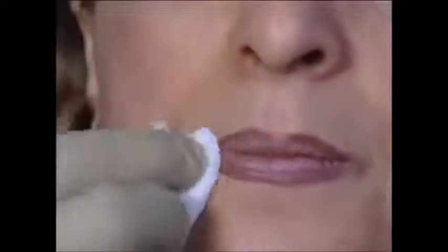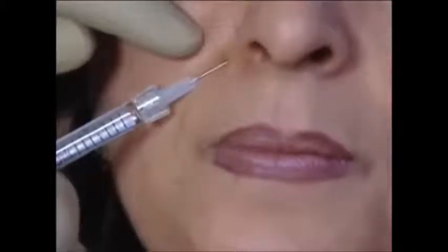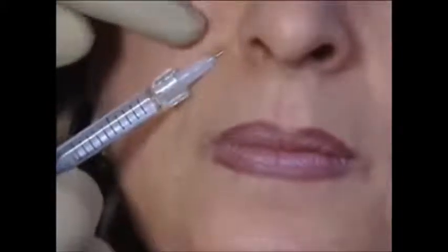Prior to injection of the nasolabial folds, a topical anesthetic is used. This patient has grade 3 nasolabial folds on the Lemperle scale. The right side is slightly different from the left and does not require as much injection. At the alar base, a fanning technique is used.